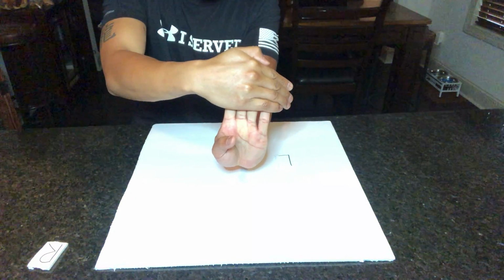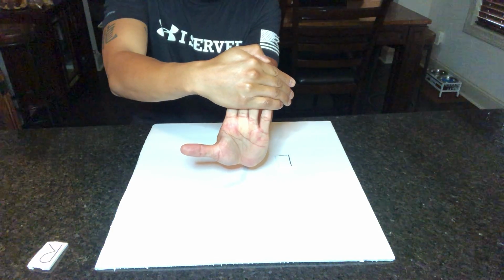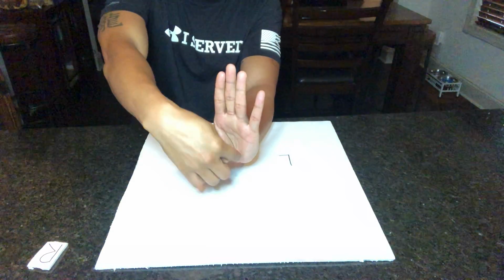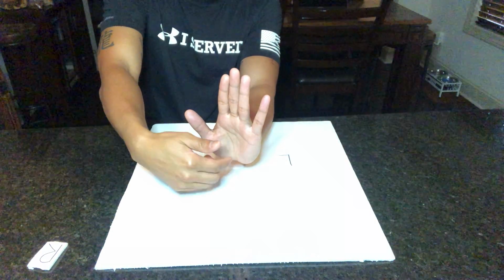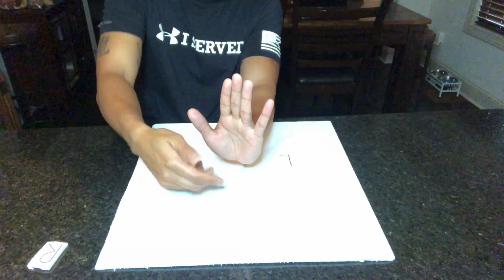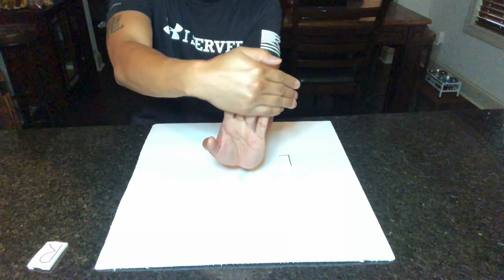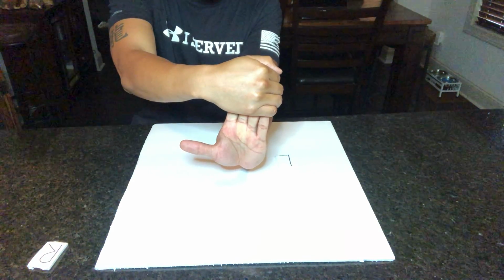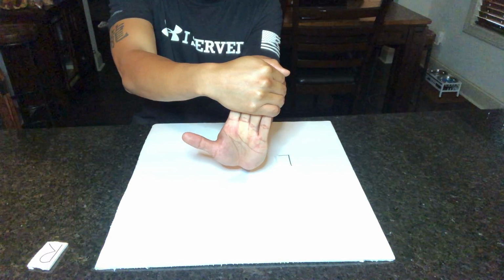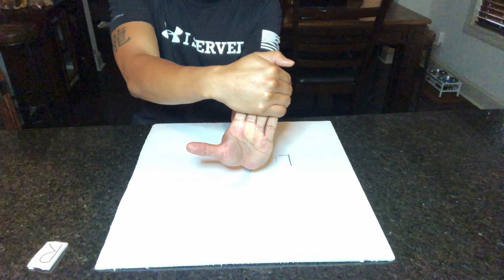The SID is 40. The cassette is an 8 by 10. Central ray is going to be 25 to 30 degrees toward the palm of the hand, which is going to be approximately 1 inch distal to the base of the fourth metacarpal. And in this particular view, we're going to look at the carpal tunnel, pisiform, triquetrum, capitate, hamate, and the greater and lesser multangular.